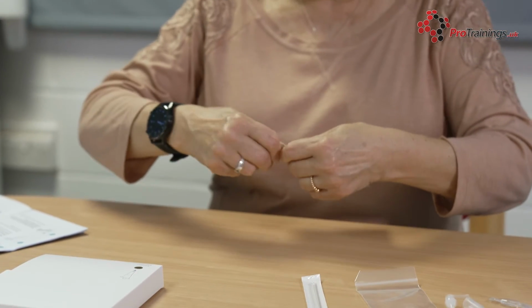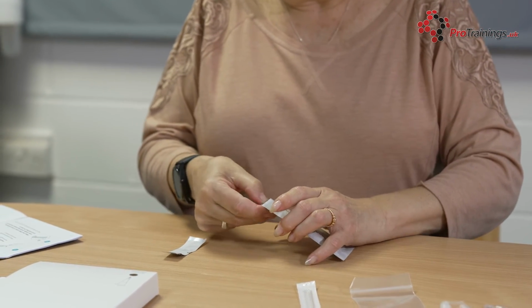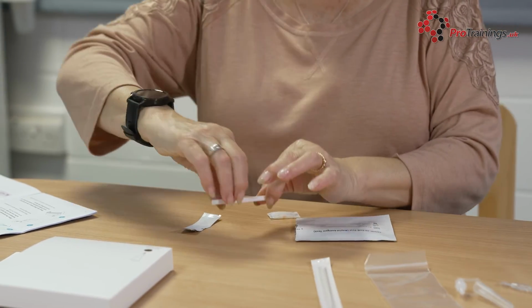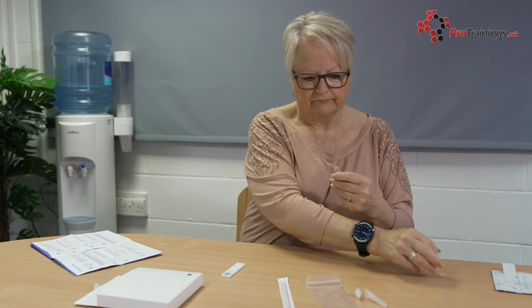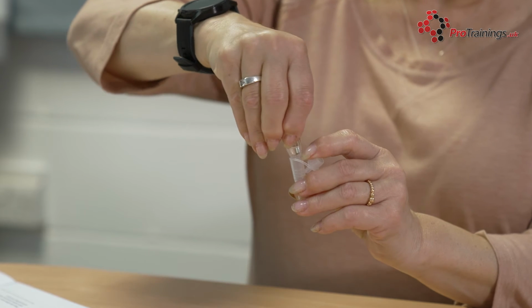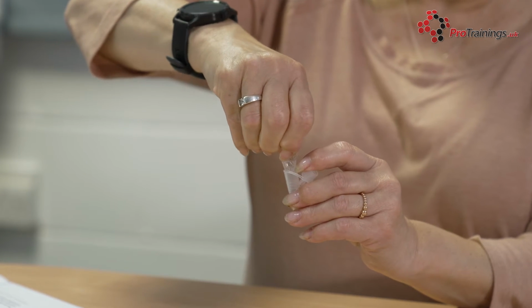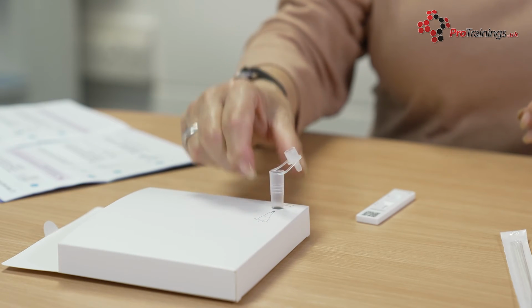You set up for the test by taking the test strip out of the packaging and placing it on a clean, flat surface. Once opened, the test must be used within 30 minutes. Carefully twist or snap open the sachet, but be careful not to spill the fluid or splash it in your face. Open the extraction tube and gently squeeze all of the liquid from the sachet into the tube. Place the filled tube in the extraction tube holder to avoid spilling the liquid.